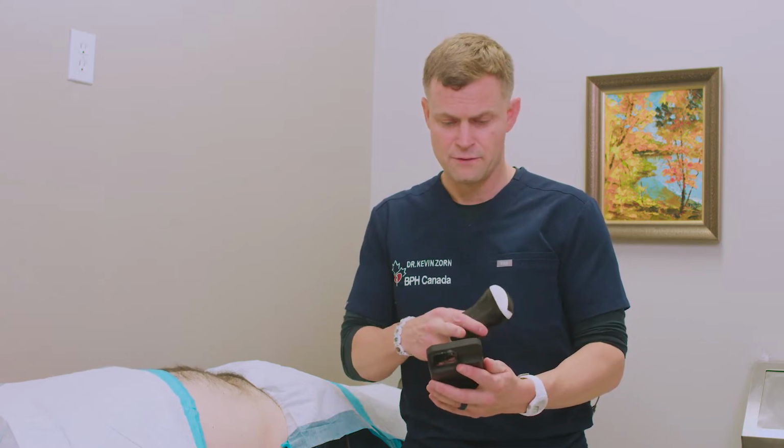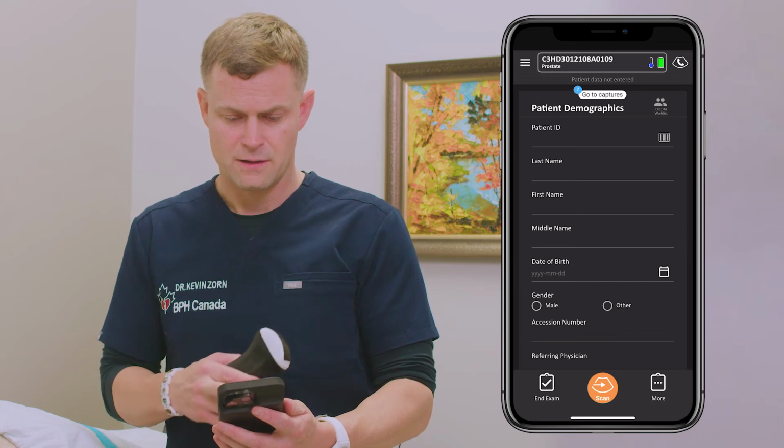So there, all within a matter of a few minutes, I've got the pertinent information for anyone with BPH or lower urinary tract symptoms, where we will have their bladder status, their bladder wall thickness, making sure there's no secondary endpoints of chronic BPH, such as diverticulum or stones. And finally, the prostate anatomy, the length, height, and width, and the absence or presence of a median lobe. So this completes the ultrasound findings, and I'm going to go ahead now and move toward a final summary report.